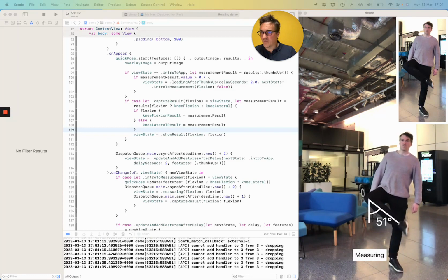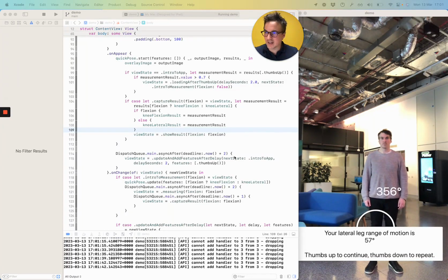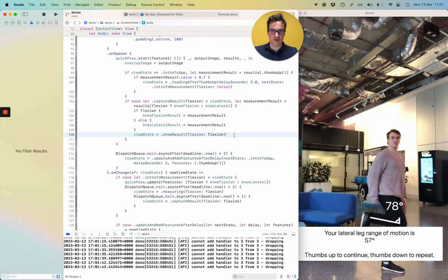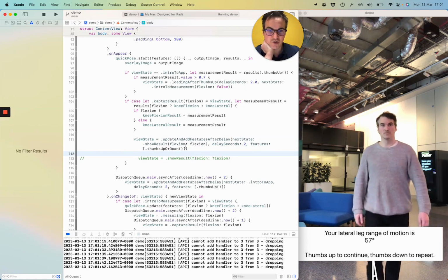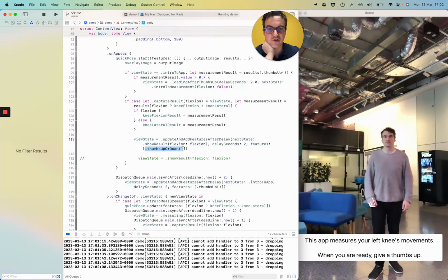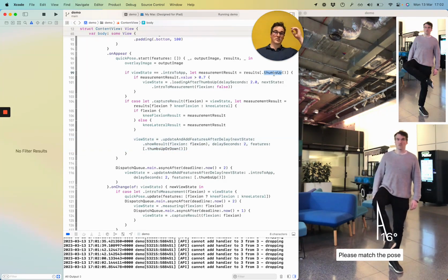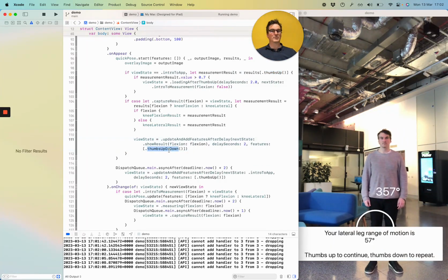So I want to do a different type of detector now. This would allow me here, instead of going straight to on capture result, show result, I want to specify a new state which shows the result, but after a delay of 2 seconds, I want it to show the thumbs up or down feature. So previously we used the thumbs up. That's basically just says, is there a thumbs up or not with this probability? The thumbs up or down is a bit more complicated. It allows you to say a sort of down state as well.